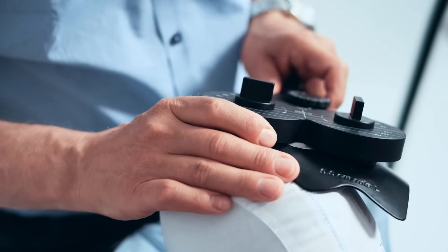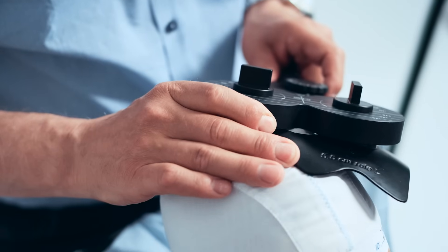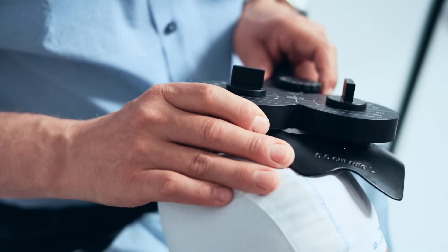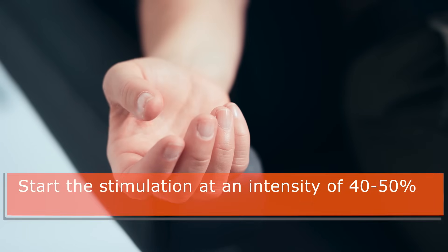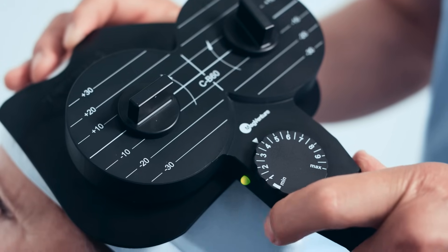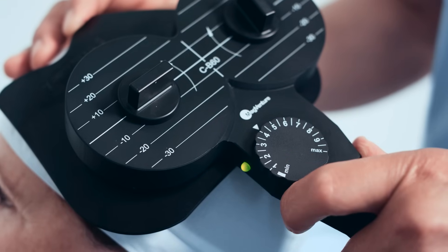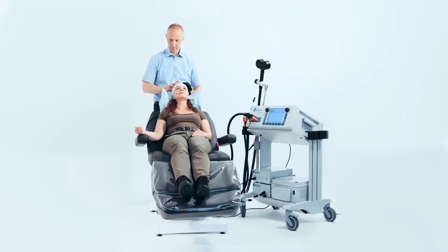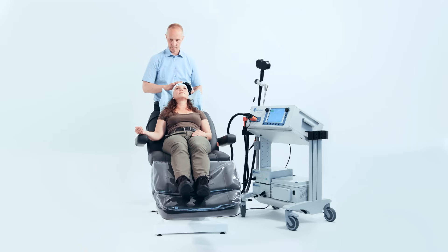Place the center of the coil at the midpoint of the dotted line and start searching for the motor threshold spot by delivering single stimulations while moving the coil in small increments along the line, continuously observing the thumb for a twitch. Start the stimulation at an intensity of 40 to 50%. If no response, gradually increase the intensity until a response is observed. A random interval between the single stimulations of between 6 to 9 seconds is recommended. Once the location of the most robust response is found, incrementally lower the intensity to find the lowest possible value where a twitch is still observed in 5 out of 10 stimulations. This stimulation intensity value is the individual patient's motor threshold.